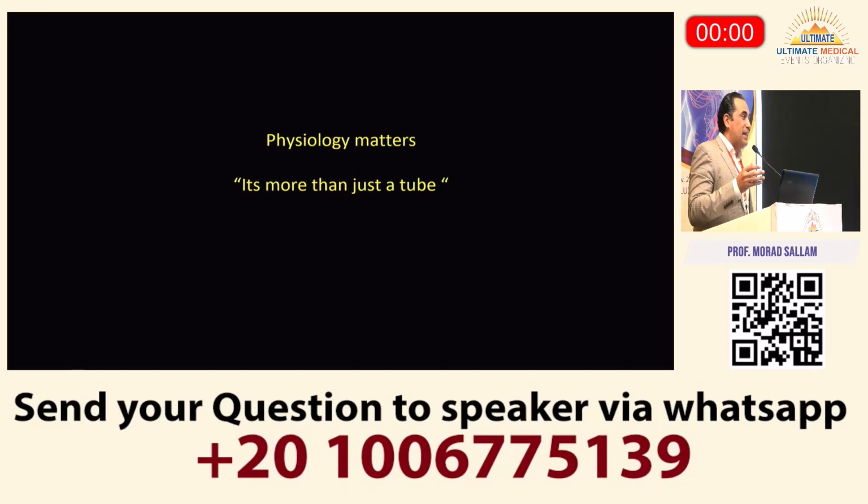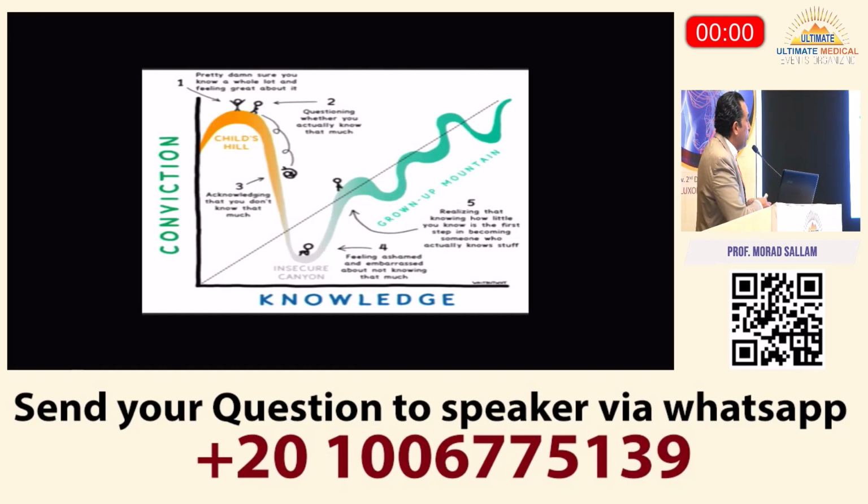So it's not really a tube that we are putting in, and we are understanding as we come closer to the heart that the current technology that we have as a tube is probably not going to work as well as it worked in the infrarenal and descending thoracic. We need something to respect the arch, not only anatomy, physiology and pulsatile flow, and a lot of evidence is coming up on that. When I started, I thought we were here. I think we are dropped down now a little bit more, knowing a bit more about thoracic disease and endovascular, and we are on the up curve of learning.